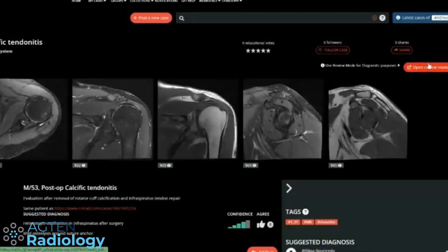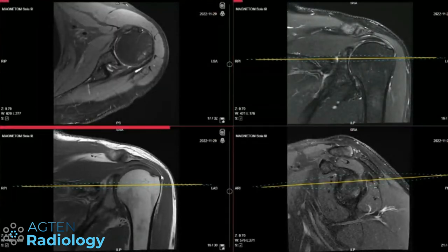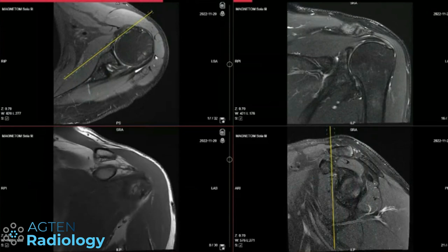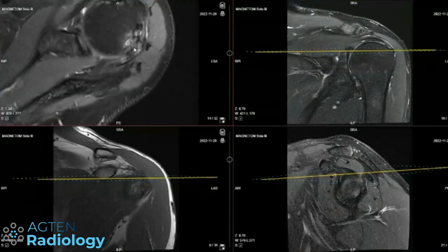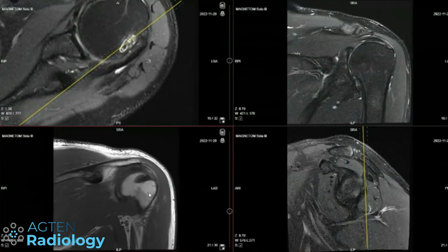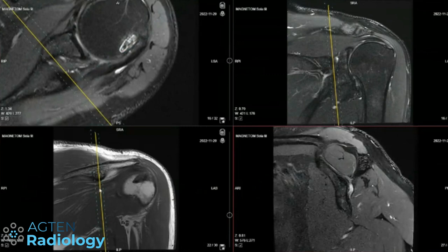This is an interesting case. This person had calcified tendonitis, underwent surgery to have the calcification removed. Something happened during or after the procedure and they had to repair the tendon. There's some unusual-looking signal on the infraspinatus on the T1 — there's what looks like heterotopic ossification inside.